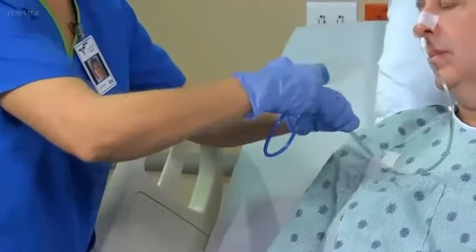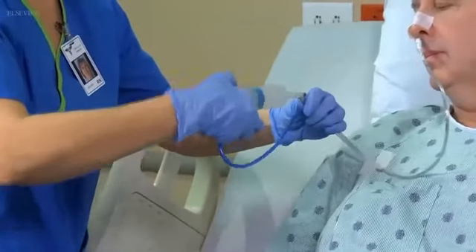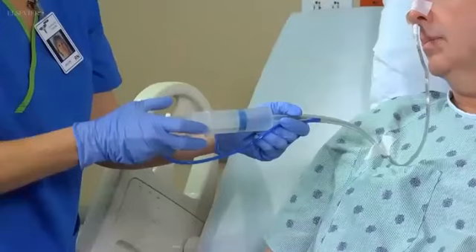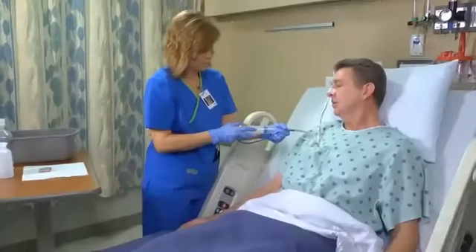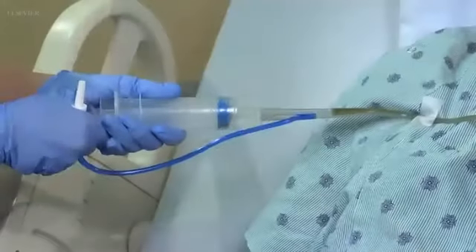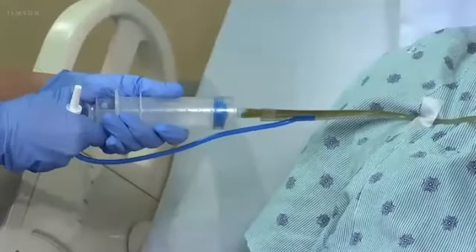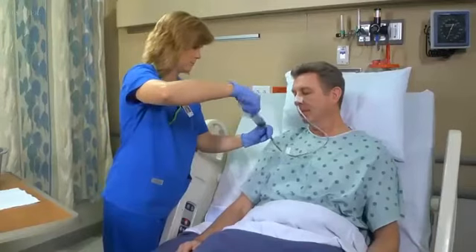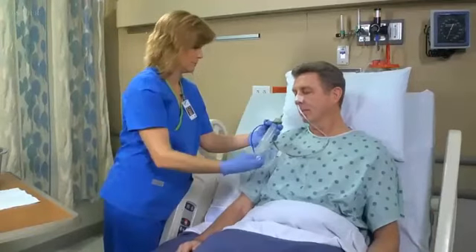Flush the tube with 30 milliliters of air before attempting to aspirate stomach contents. Reposition the patient from side to side if necessary. More than 1 bolus of air may be required. Slowly draw back on the syringe until you've obtained 5 to 10 milliliters of gastric aspirate. Note the appearance of the fluid.